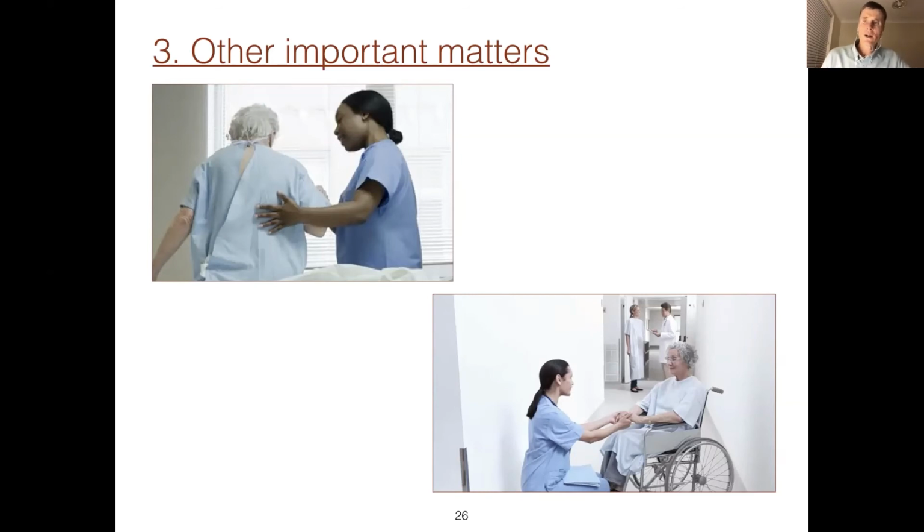And almost always a patient will want to know something about things. Now, this is just a reminder that we need to be prudent here and say, yes, I've got good images and measurements, and I will be able to report those.